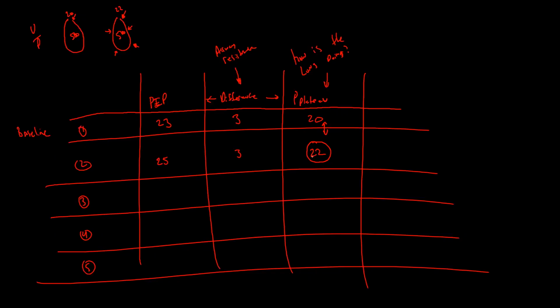And if you want to know what compliance is, I sometimes don't want to put it here, but we're going to put it here. So compliance. This is baseline. This means the compliance is getting lower. Because that's probably what the test is going to ask you. It'll say, here are your values. Is the compliance increasing or decreasing? Sometimes it has that one diagram that has all of the arrows. Increase, decrease, increase, decrease.